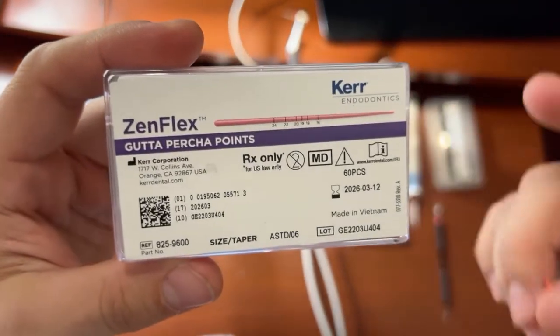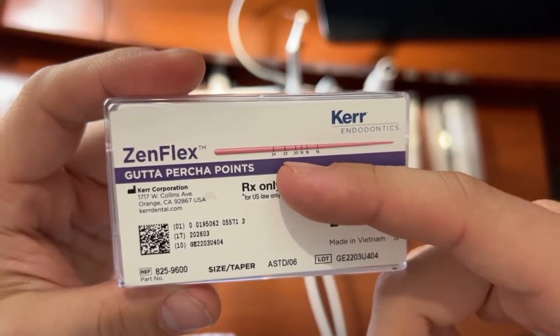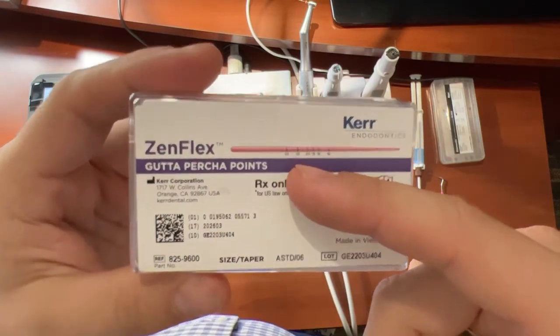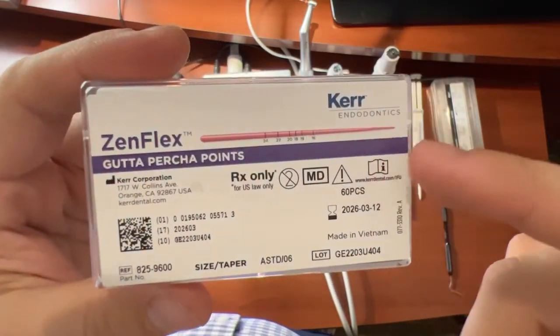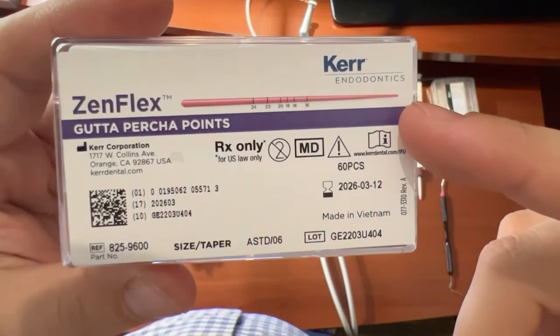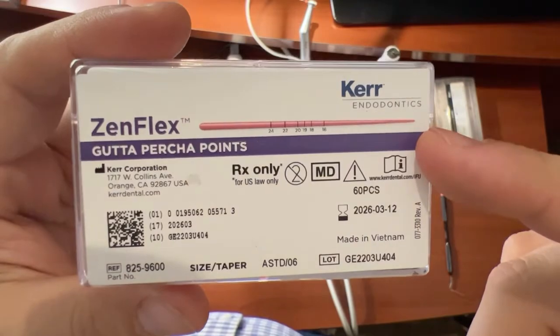And the really nice part to this, and I just love what they did with it, is as you can see here, there are little marker indicators on the gutta percha cone that actually tell you how far away you are in millimeters from the tip. So you can see it's got 24, 22, 20, 19, 18, and 16.